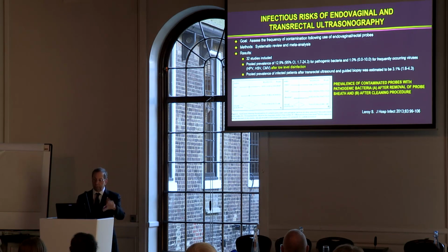So again, a whole host of studies showing that. And the pooled prevalence of infected patients after transrectal ultrasound-guided biopsy was estimated to be 3.1%. As you can see, the prevalence of contaminated probes with pathogenic bacteria after removal of the probe sheath, again covered, and after the cleaning procedure.